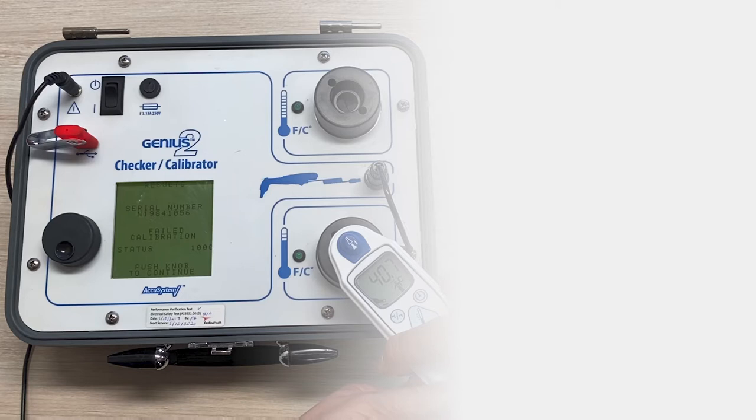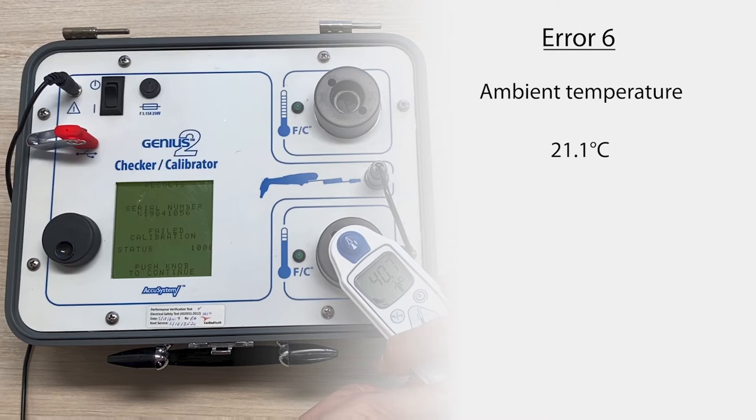Now looking at some of the potential errors that may come up during calibration. Error 6 relates to the ambient temperature. Try and find a room that is fairly stable in temperature. The ambient temperature must be between 21.1 degrees Celsius and 26.7 degrees Celsius and free of any drafts. Around 23 degrees Celsius is what usually works best. The calibrator, the thermometers, and the probe covers must all be acclimated to this temperature.